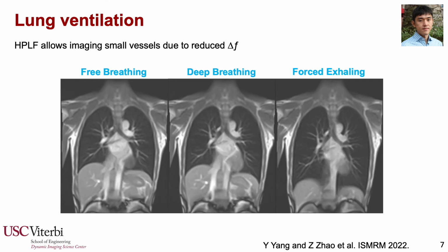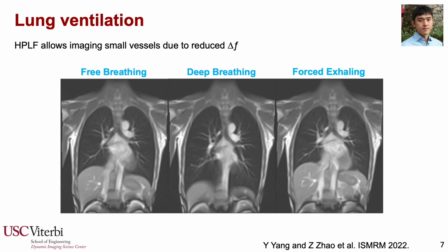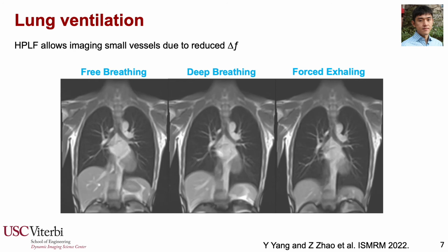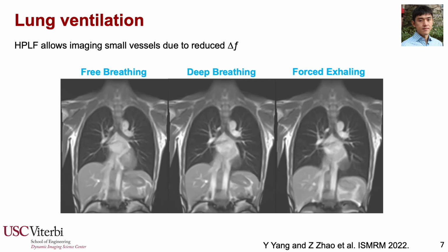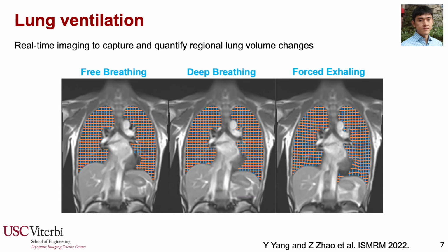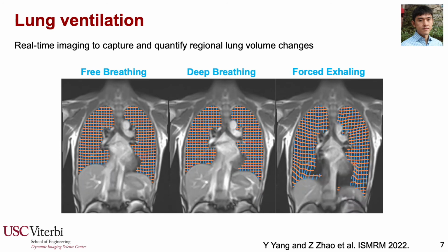And by having this detailed structure, the automatic algorithm can use these tiny structures as landmarks to guide the image registration. And from this image registration, we can quantify the regional lung movement and further evaluate the regional lung functions.